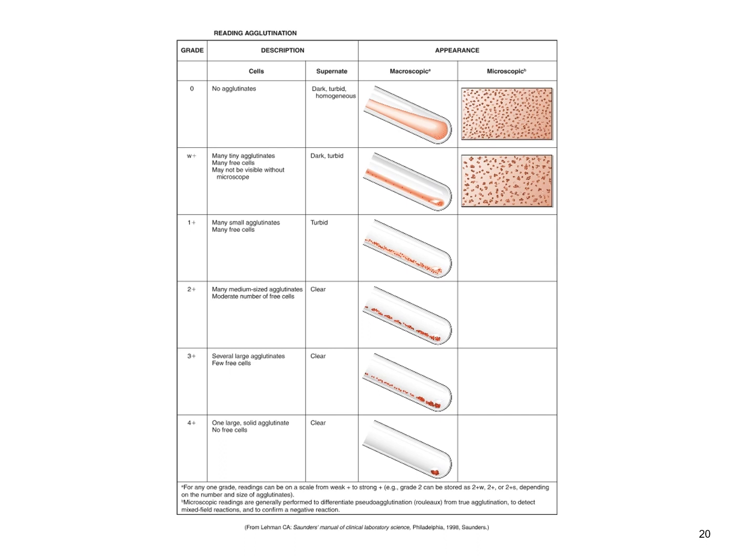But again, basically you've got your negative, there's no agglutination, your weak reactions. A lot of people will refer to this as microscopic. You can usually tell a little bit is happening if you look at it in the tube, but then once you go under the scope, you start seeing those aggregates taking place. You can see those little clumps that are happening.